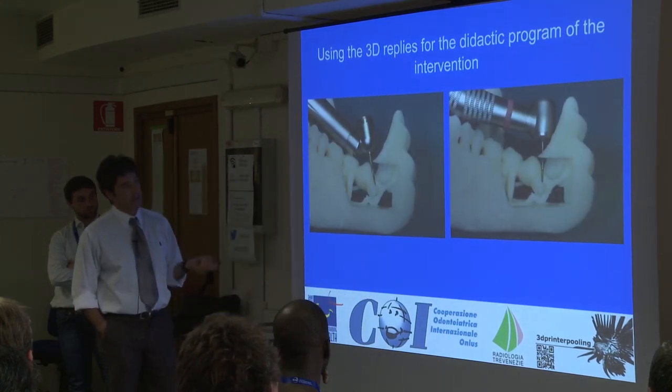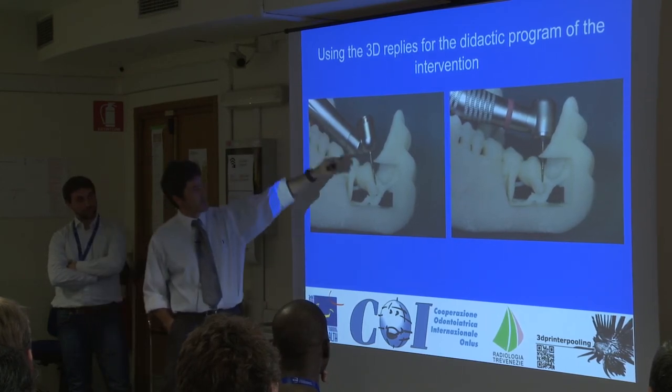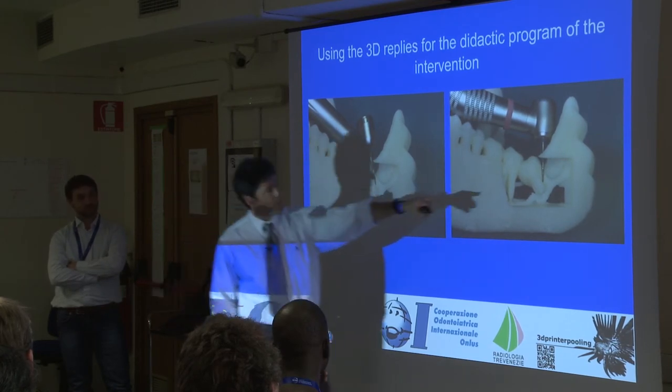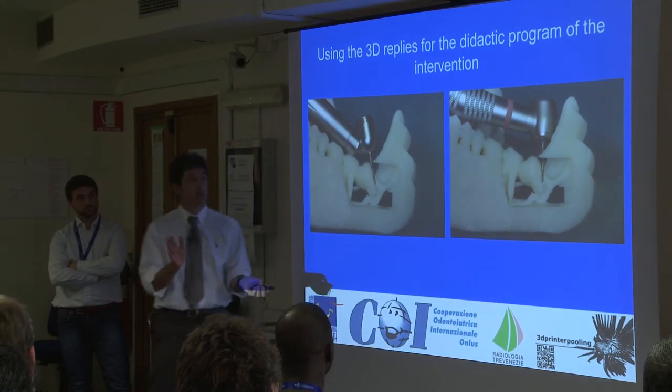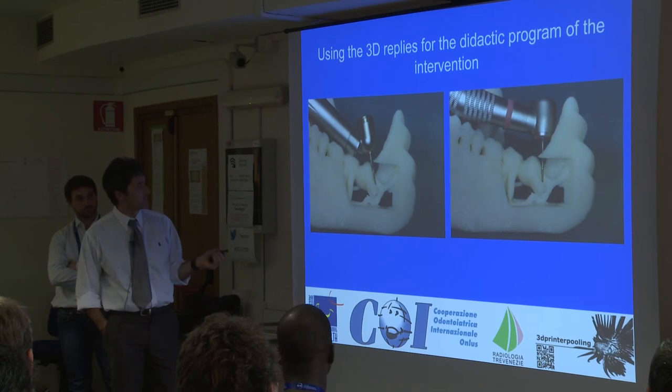So I can try to choose the right instrument. This is a contra-angle with a drill. I choose the drill. It's different from this. Here I need the patient to open his mouth more and more, because of another angulation of my drilling machine.